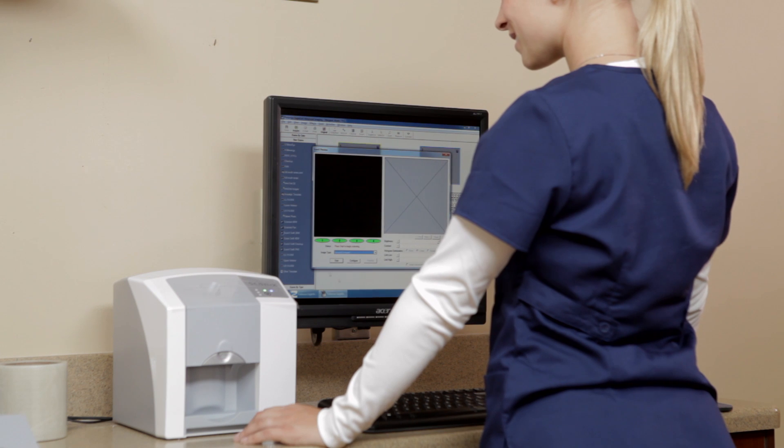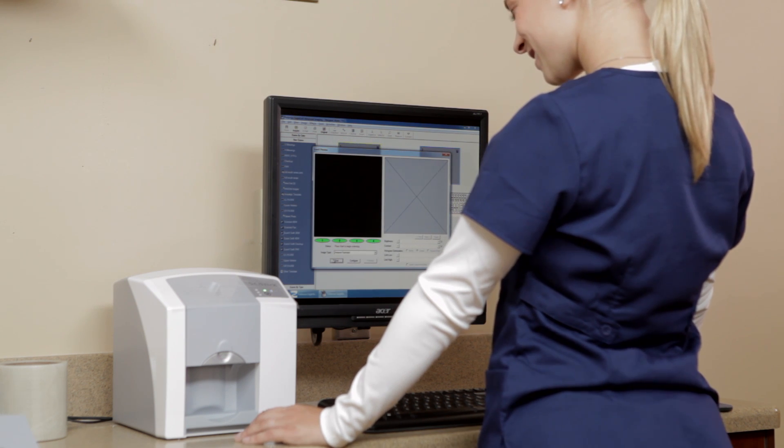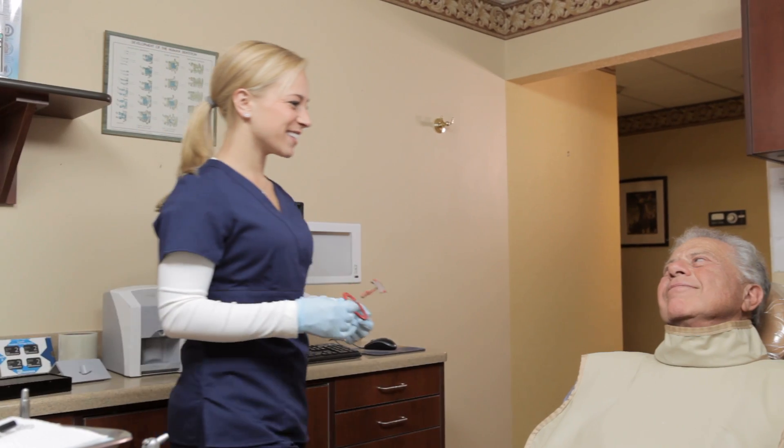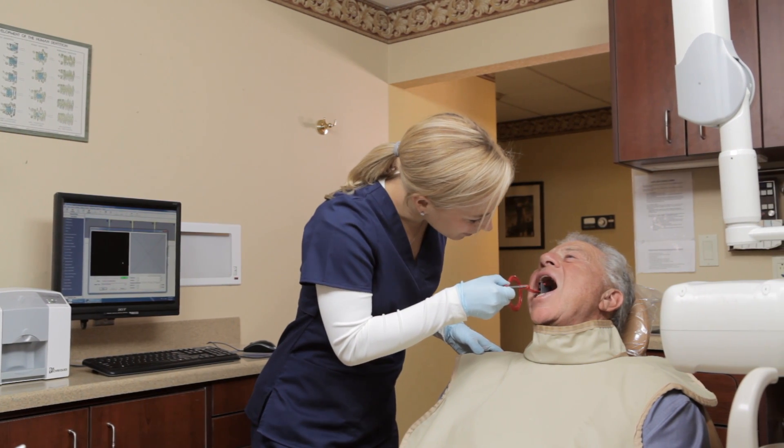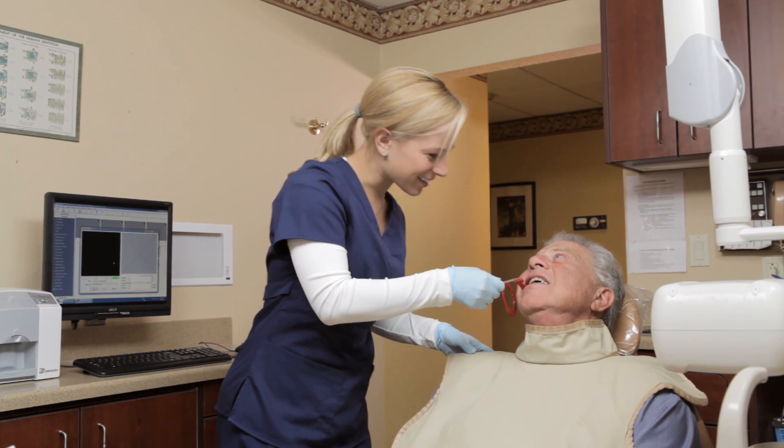Start the imaging software, selecting the patient and the desired resolution. Place the sensor in the patient's mouth as usual using a standard positioning guide, as we are showing here, or a bite wing tab.